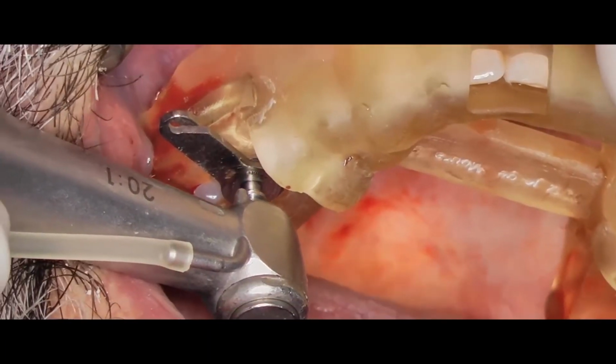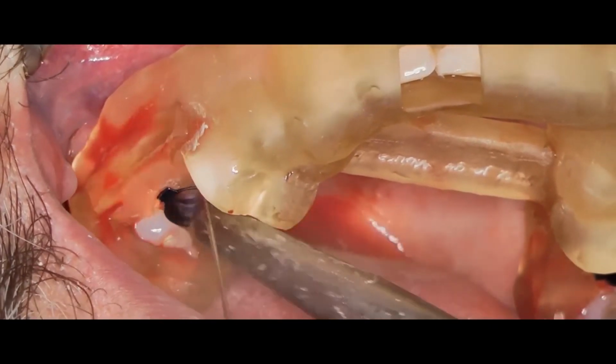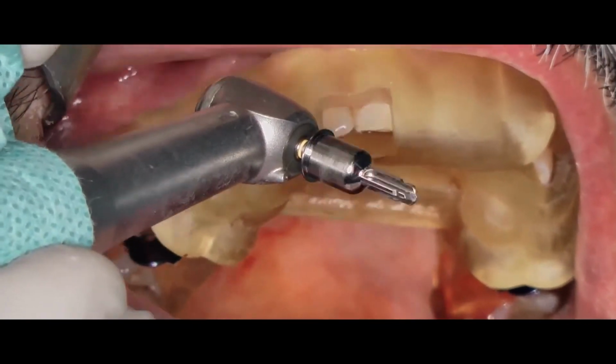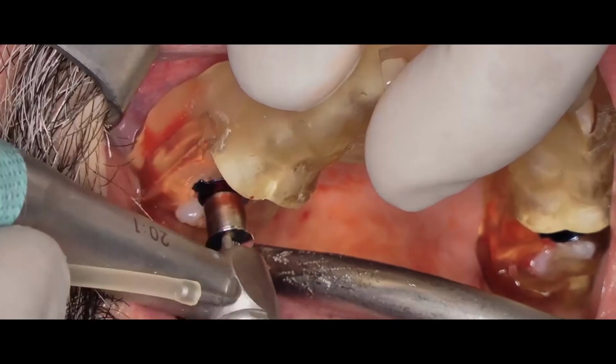Here you can see me using it without irrigation, drilling at low speed, always irrigating between burrs. Now, for the 2.7 burr, again, we start with a shorter burr and proceed to use a longer size.